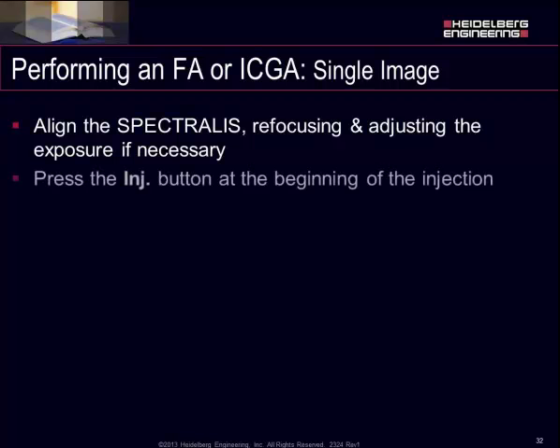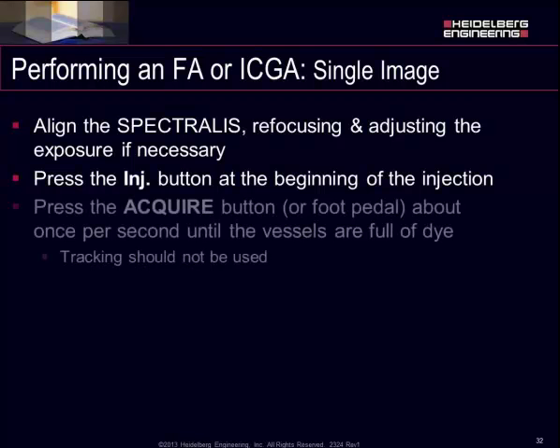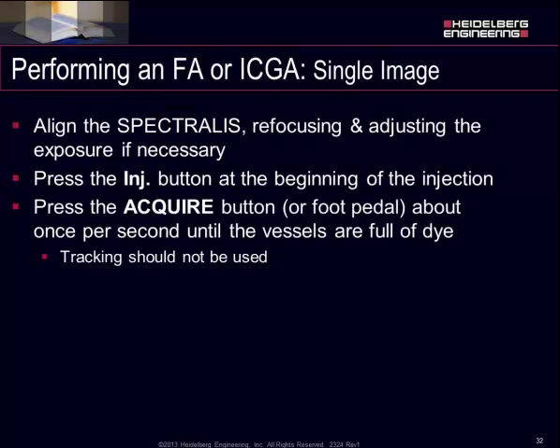When the injection starts, you'll press the injection button. And then start acquiring images as the dye enters the eye. If I'm going to do the single image, I'll start acquiring images around 10 to 12 seconds.